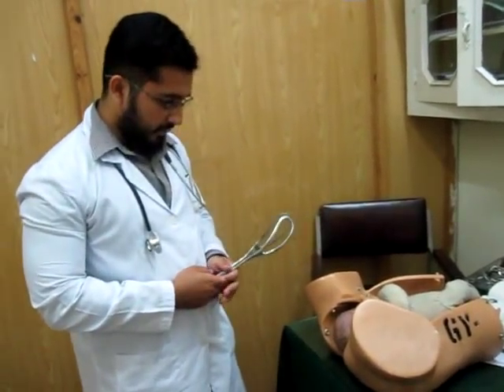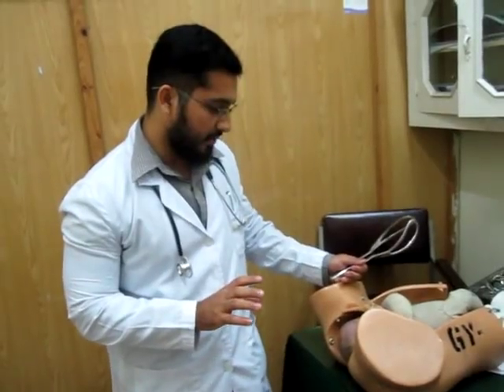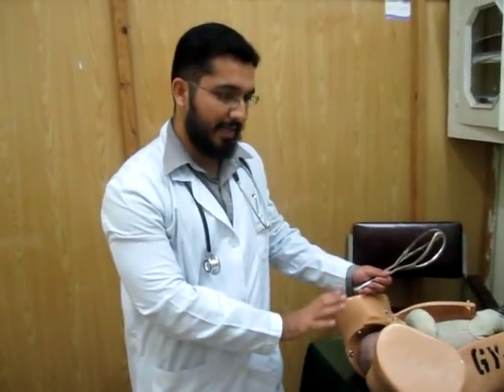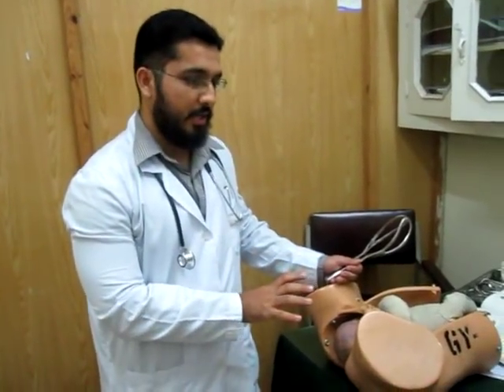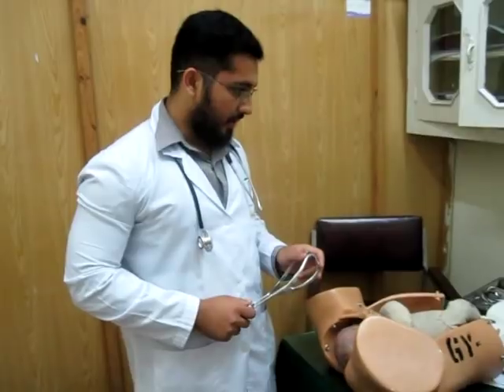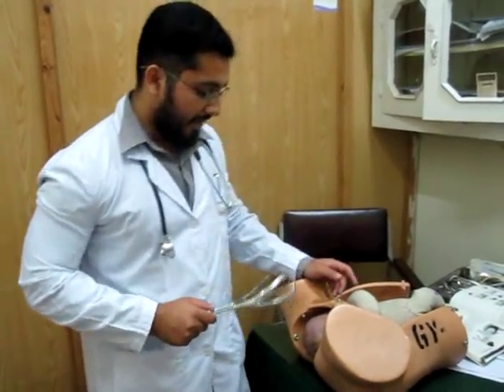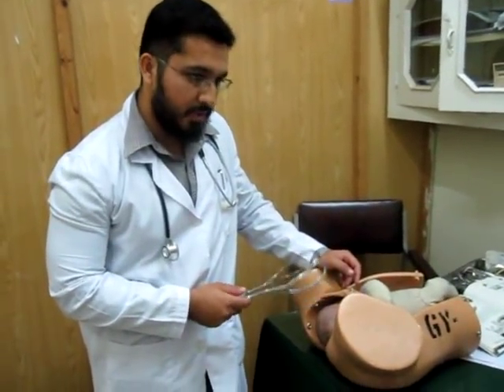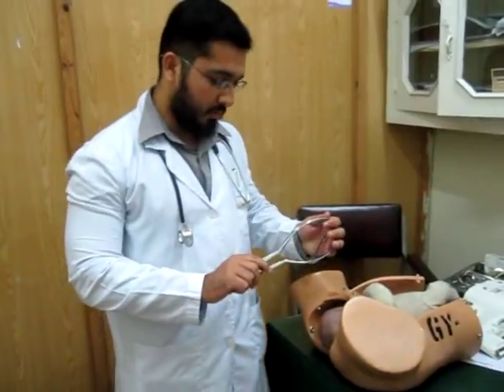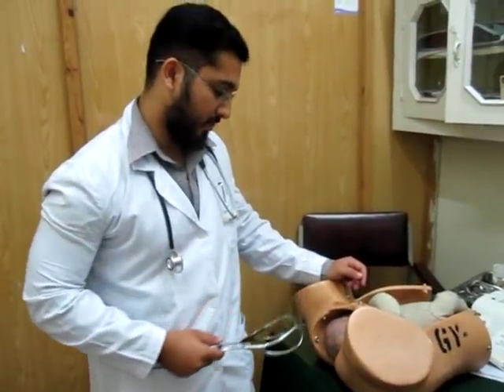For the method of applying forceps, we need some prerequisites first. There should be no CPD, the head should be engaged, and we usually apply the Wrigley's forceps in our hospital. The other forceps are too large; patients in those cases usually go for C-section. The head should be at plus two station or below, because the Wrigley's forceps are small and only work when the head is at or below plus two station.